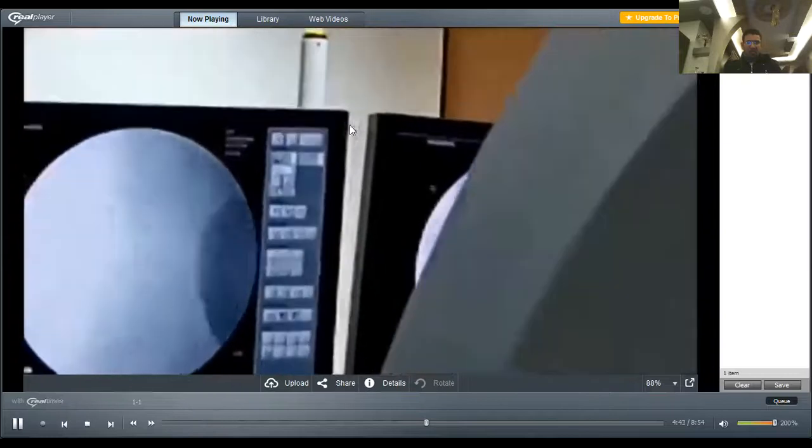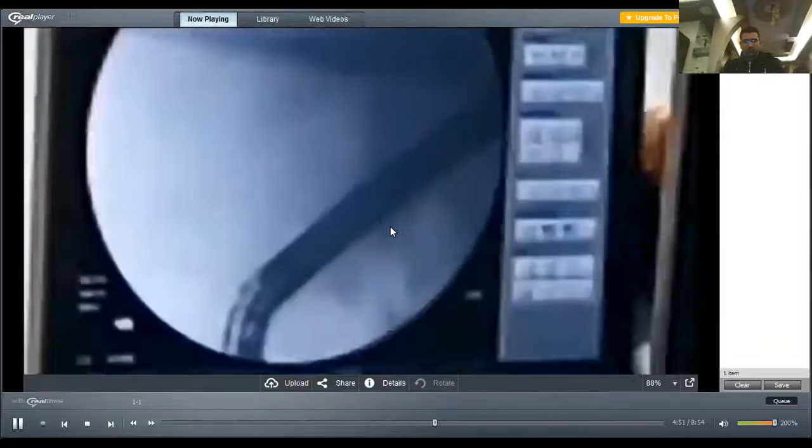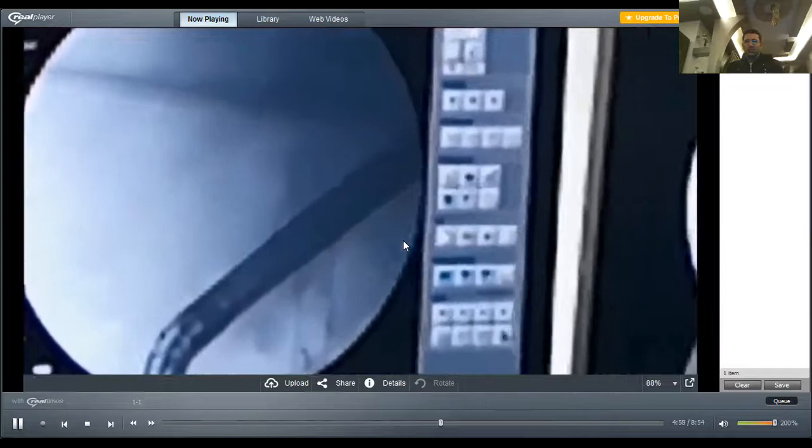Now we will look at the cholangiography to confirm that we are maintaining the guide wire above the level of the obstructed stent. And if we look here, unfortunately, it is still not passing the upper end of the obstructed stent.